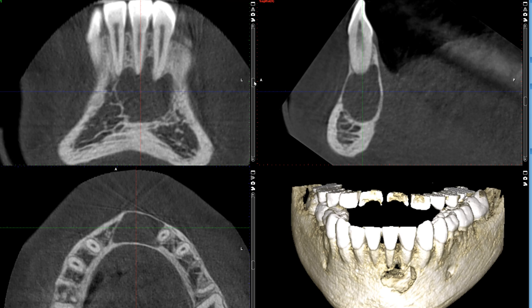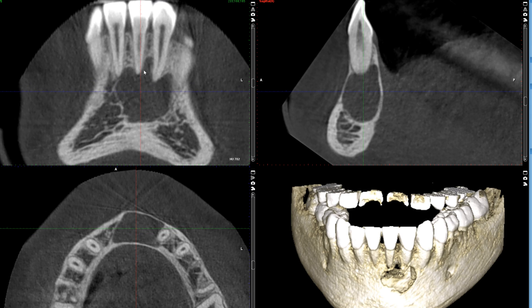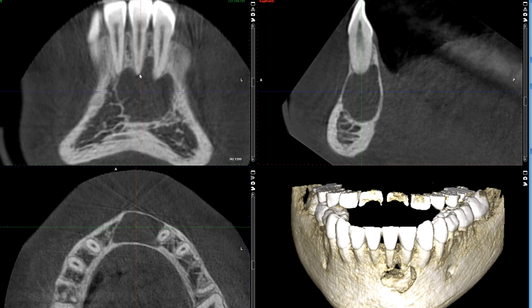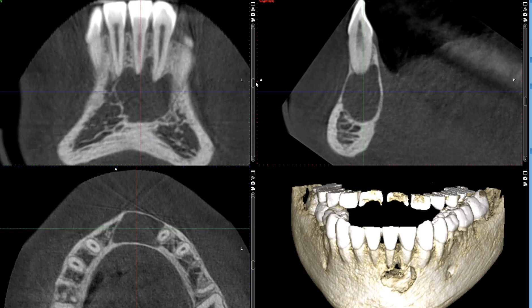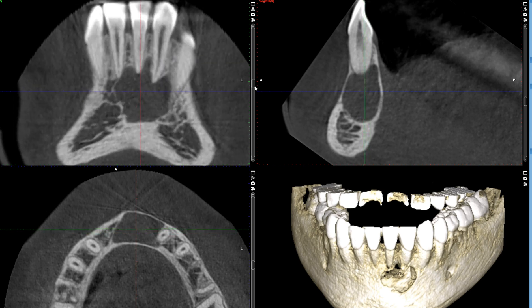Looking at the coronal view, we can see that it has a scalloping nature between the roots, which wasn't as readily visualized on the panoramic radiograph. As I scroll back and forth, you can see that it's scalloping around the apices of these teeth. However, as seen here and on the panoramic radiograph, there is no obvious sign of root displacement or resorption at this point.